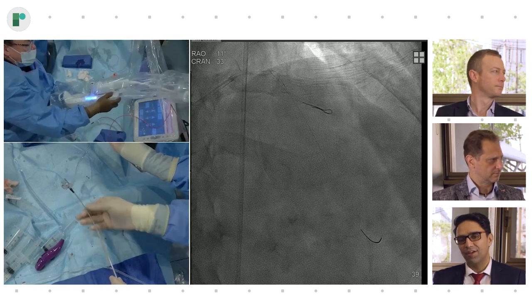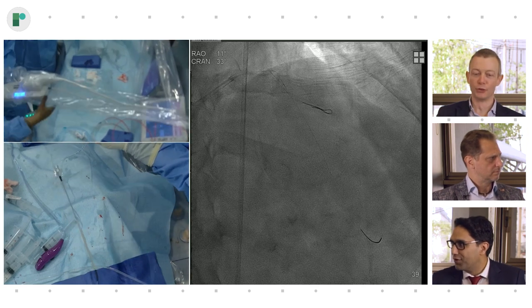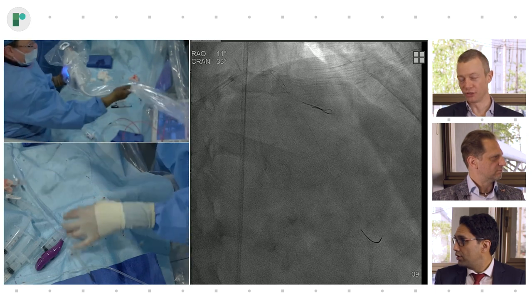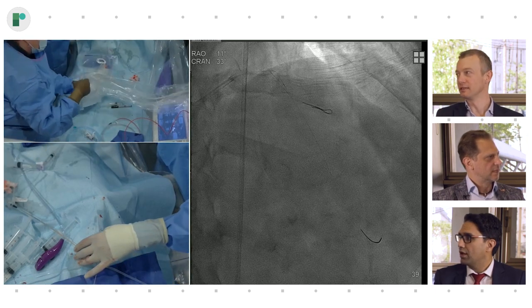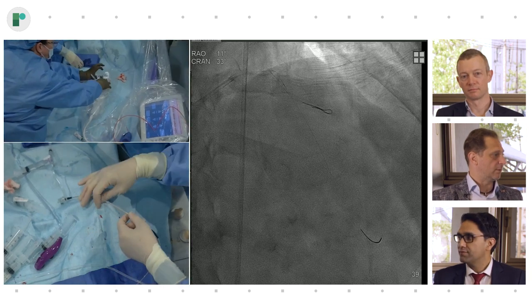And then honestly, in those situations, Joost, we're doing a lot of manual, right? You guys do a lot of manual. Only for you close. You don't use the manual at all? No, just to get in, and that's it. Really? Okay. Yeah. So let me tell you how we do it and why I think the manual helps you in combination with the pullback.